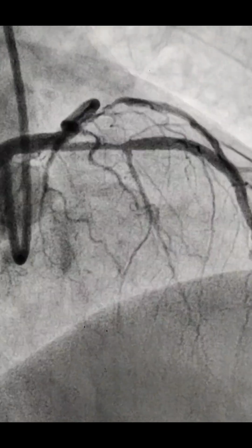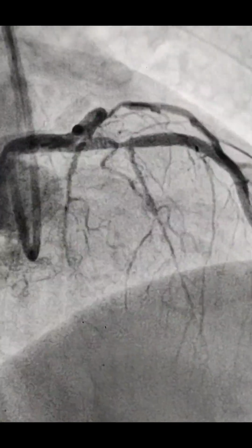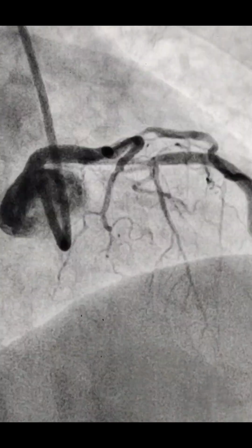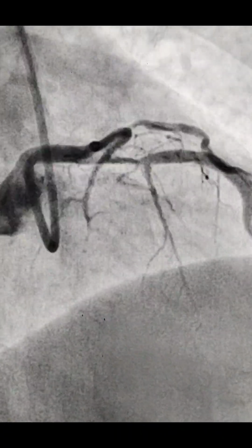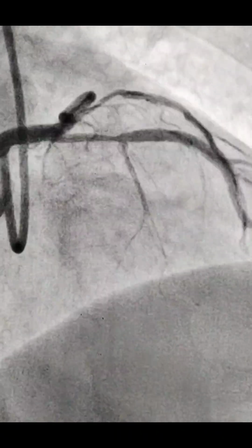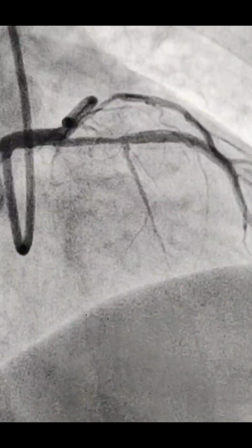This was a cranial shot. The plan is to put a stent right from the ostium of the LAD, wanting to nail the ostium. There are two techniques in the ostial LAD. Either you do the crossover, that is stenting from the distal left main to the LAD ostium, or the second is nailing the ostium.